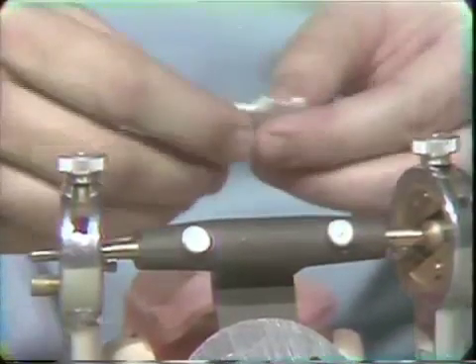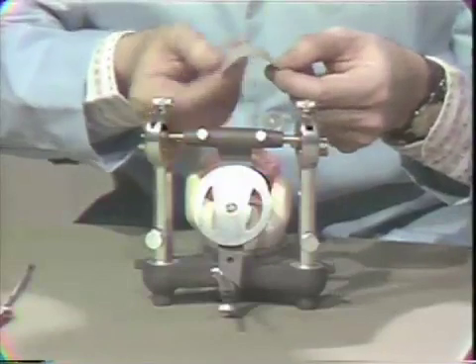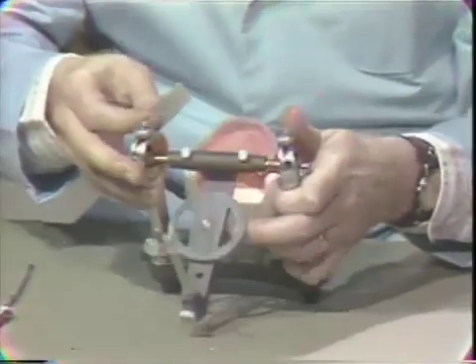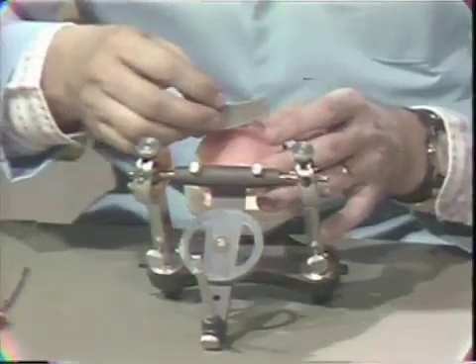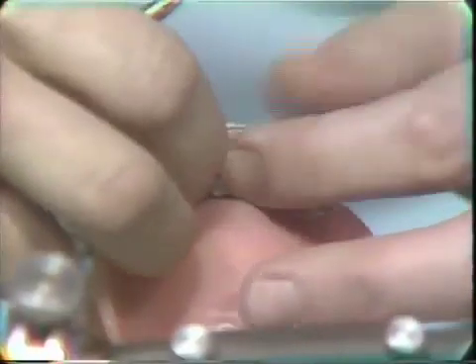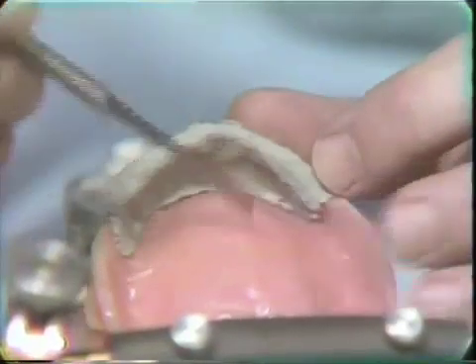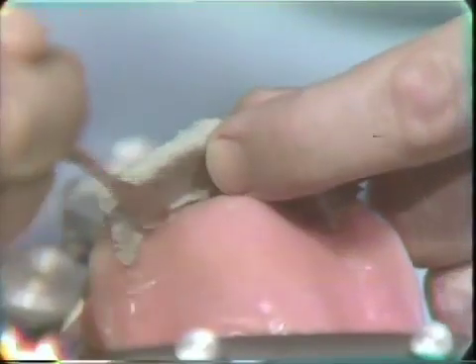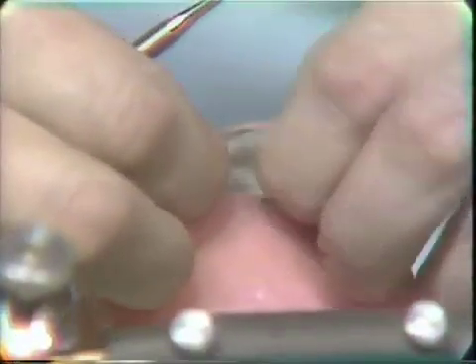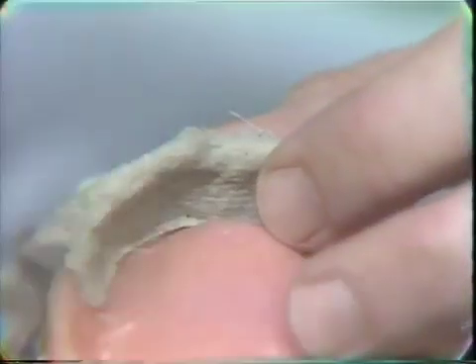So with a small strip of asbestos — in fact this is the type used for casting — I'm going to use only half of the width. I'm simply dipping it in water for just a second. That's wetted now. Then in the labial portion, I'm simply placing this in the labial area and adapting it over the front so it just stays a little better. Now don't make this excessive because remember this has to be held well enough by the plaster so that it doesn't fall apart during our selective grinding. But it will help deflasking by hand if we do block out this area. I only have one thickness of the asbestos strip in this case and that is plenty.